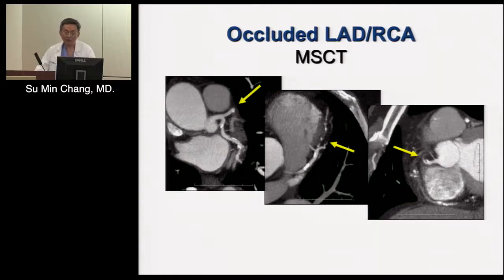I mean, you help make the diagnosis of coronary disease, the patient has symptoms, and you're concerned about more extensive disease, they need to go to angiogram, coronary angiogram. We're not going to make a decision on PCI versus CABG on CTA alone. That day may come when we have enough technology, it's just not there yet.